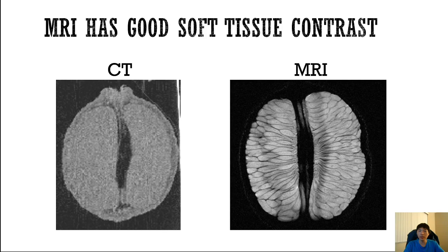So at the A&E, if someone might have experienced an injury due to an explosion, for example, and they may have metal shrapnel in their bodies, then a CT is a much safer option, which can show where the shrapnel is, or if there is shrapnel or not, compared to an MRI, where if we don't know the condition of the patient, then it's quite a high risk of injury if you put a patient with metal shrapnel in the body into the MRI.